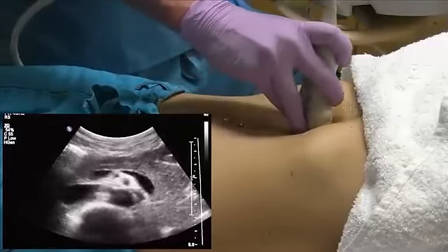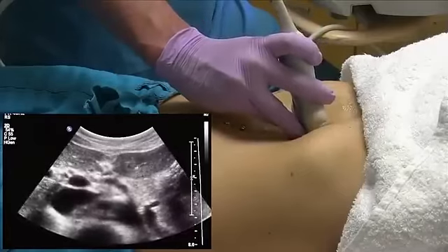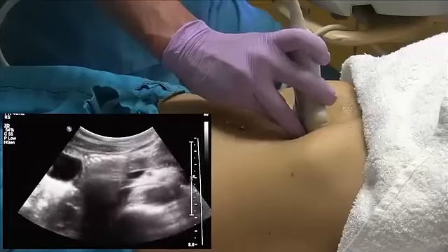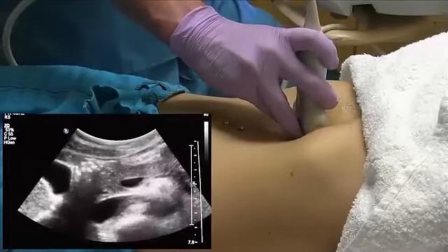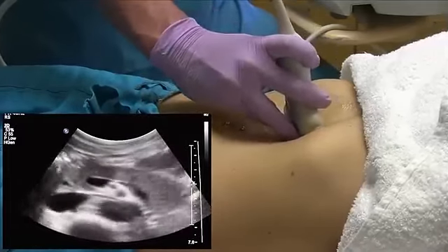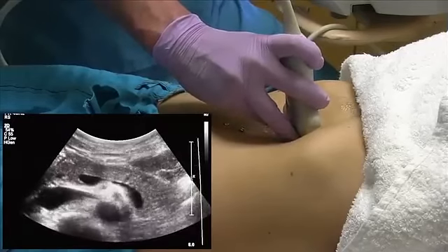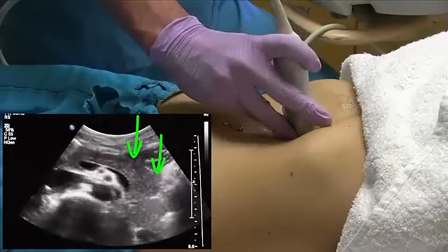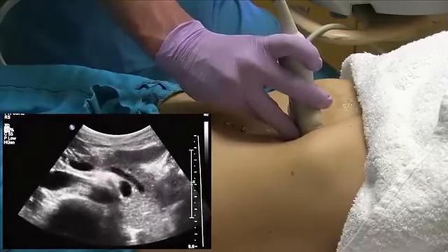We'll also try to look at the head and uncinate process all the way down to the tail of the pancreas. In most patients, you probably won't be able to see the entire tail of the pancreas just because it dives deep from this position here.